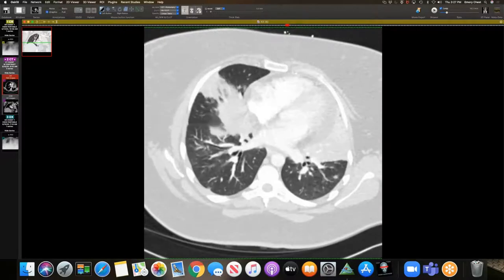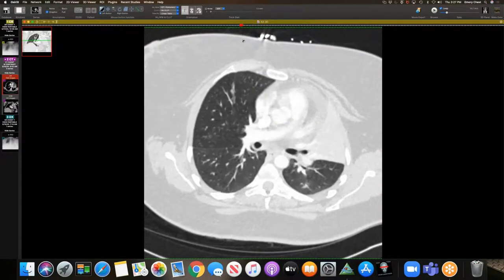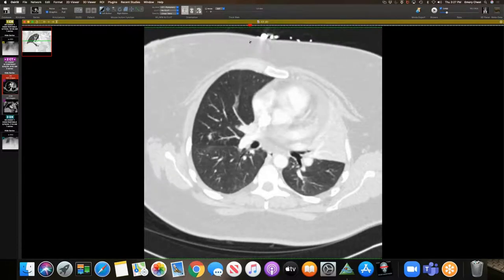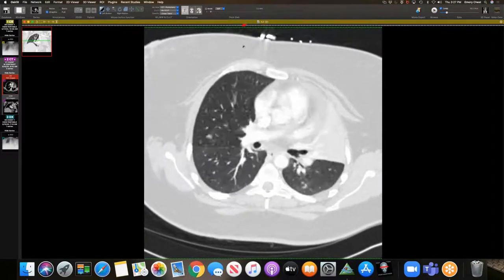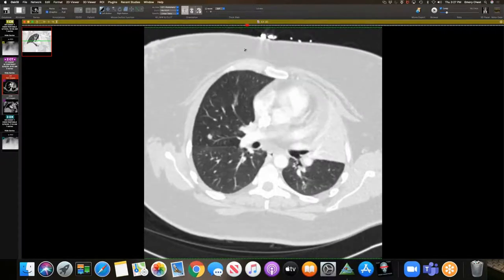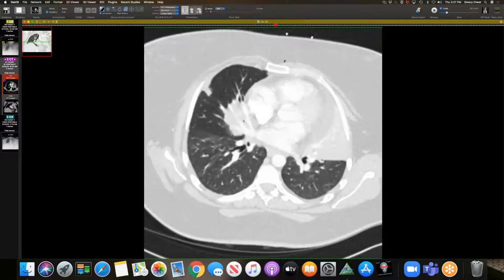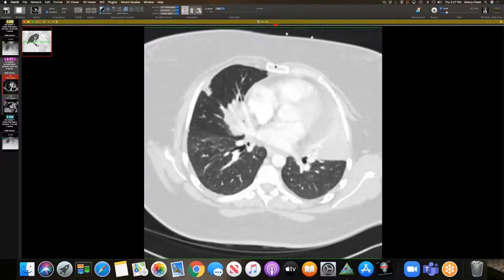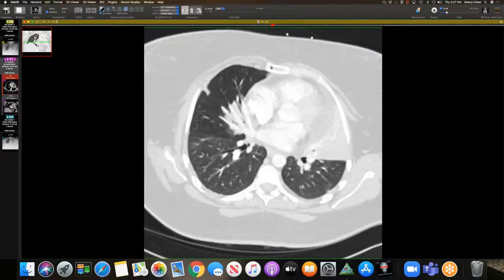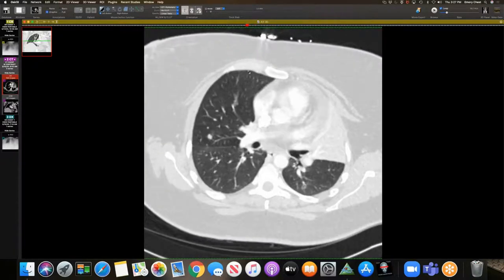Yeah, I think this is a great example. There's this back and forth argument about CT, and I think this case illustrates it nicely. You can have a positive PCR and a quote positive CT, but clearly showing different findings. If you didn't have the PCR, you'd say this looks like community acquired bacterial infection most likely, but you can't exclude it based on CT. And if the CT were normal, it wouldn't have excluded it. I think this is a great educational point with your case, and thanks for showing that.